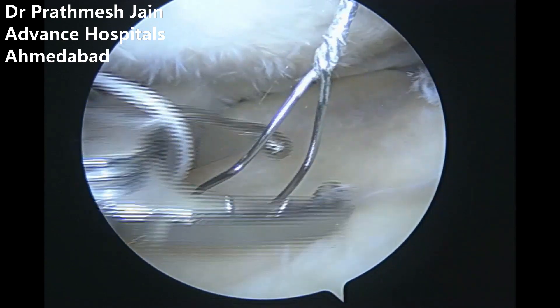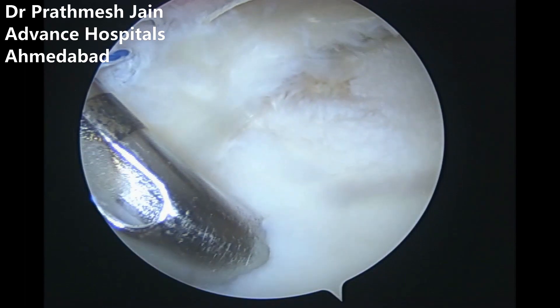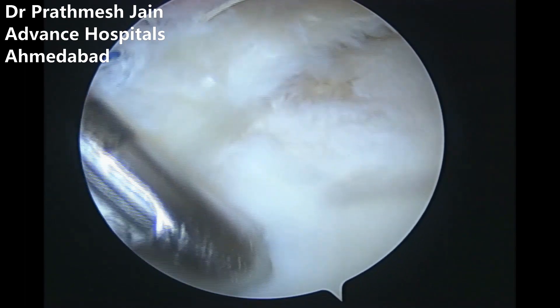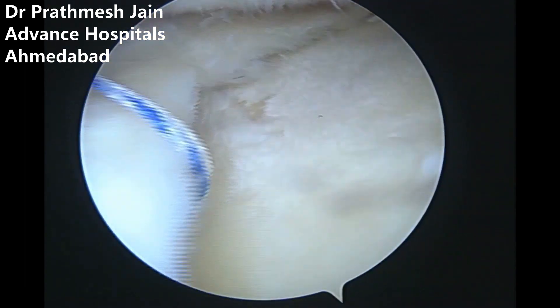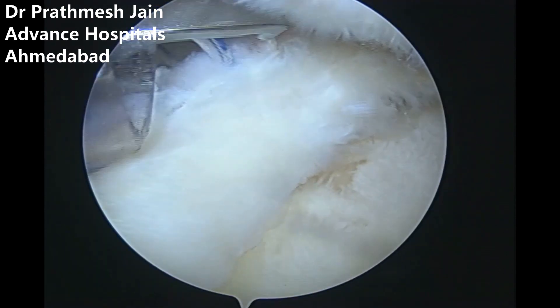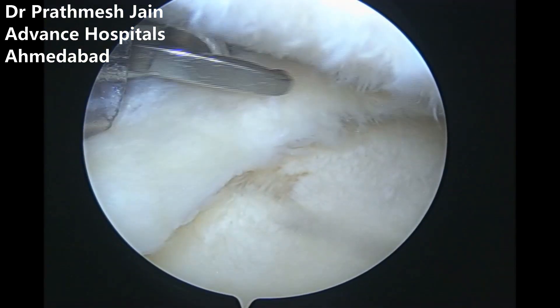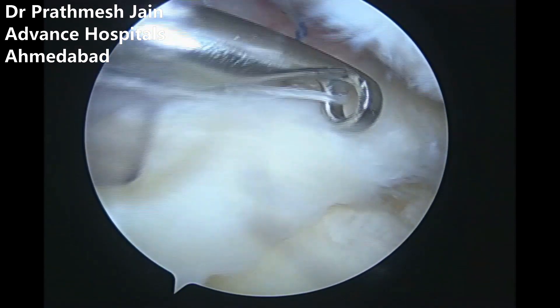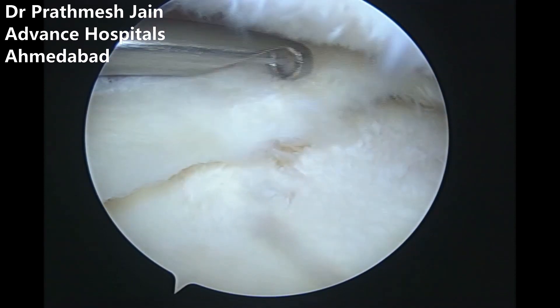The second anchor is placed just anterior to the chondral defect, which will actually reduce the meniscus from anterior to posterior. We insert the second X-fix anchor, and again sequential sutures are passed. All four suture limbs of number 0 wires are passed sequentially. We then tie the sutures one by one — all four suture limbs are tied. This leads to good coverage of the defect that was initially present.